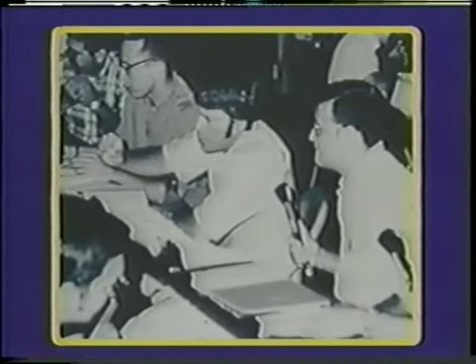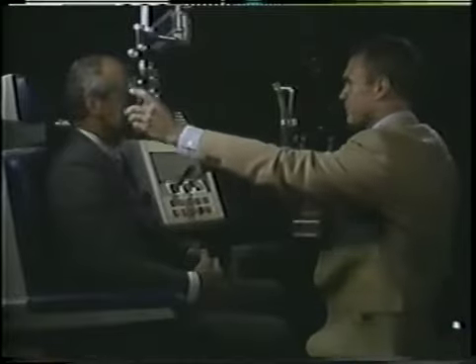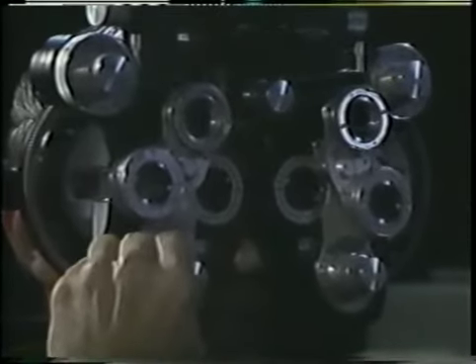Jack Copeland spent most of his life teaching ophthalmologists his techniques of streak retinoscopy. Much of what he taught was retinoscopic estimating, the refraction without the use of lenses. Most retinoscopists have never become skilled at estimating techniques because corrective lenses are so easily available. With them, the technique of neutralization is used. Neutralization of the patient's refractive error with the corrective lenses results in a characteristic appearance of the retinoscopic reflex. Neutralization is the technique to be emphasized in this program.